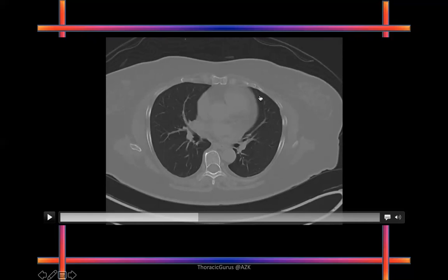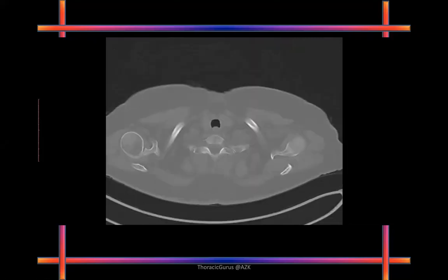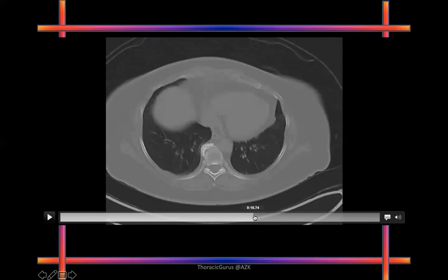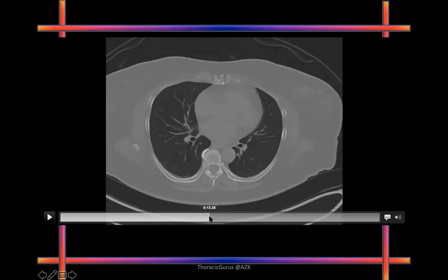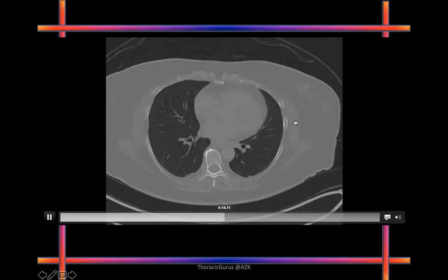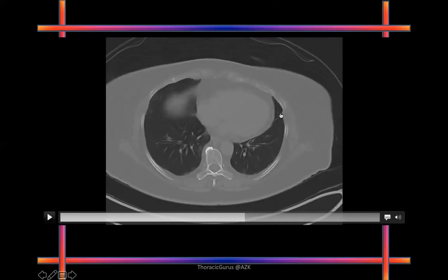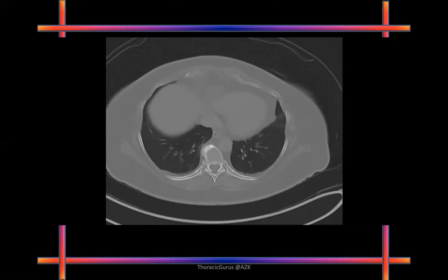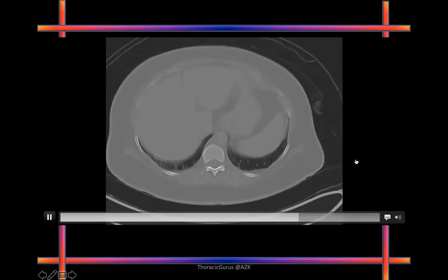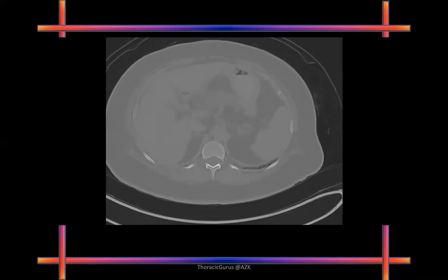This has become lingula, because you can see that. And watch the lingula, see how low it is going. Sorry about that. So this is still lingula. Can you see that? This is lingula, part of the upper lobe. Very clear understanding: as long as you know where the bronchus is going, nobody can misguide you. Is this clear now? Yes, sir. You understand the lingula very clearly? Going down is confusing. Yes, the lingula is going downwards.